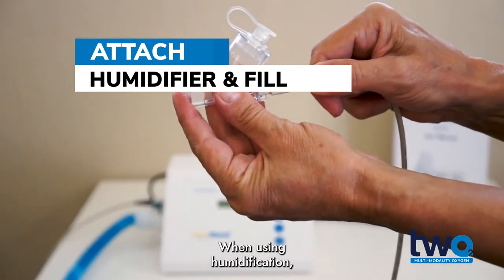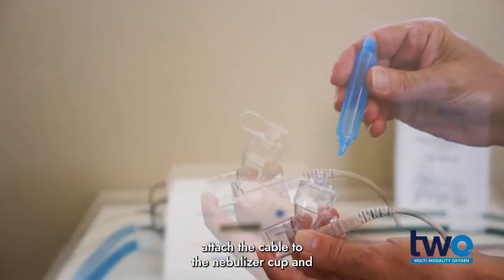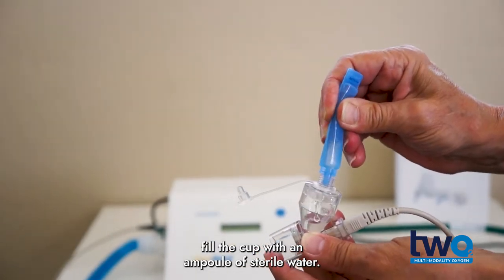When using humidification, attach the cable to the nebulizer cup and fill the cup with an ampoule of sterile water.